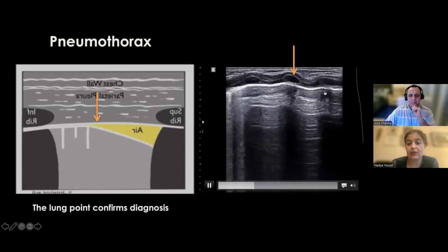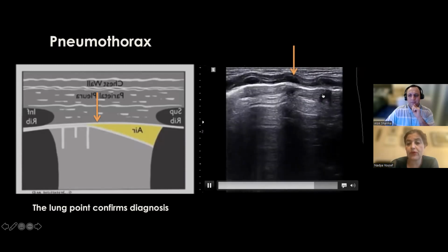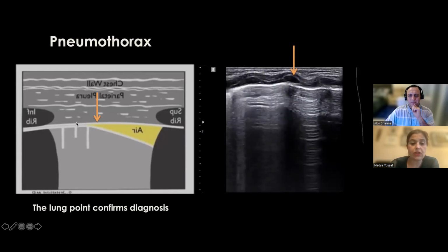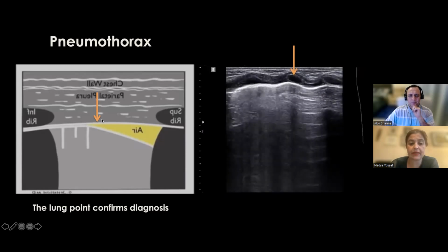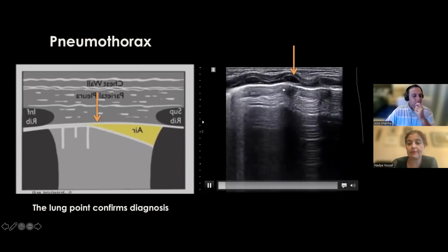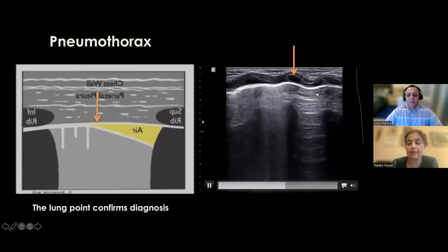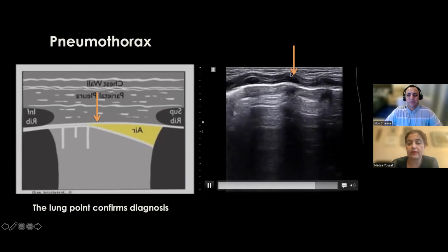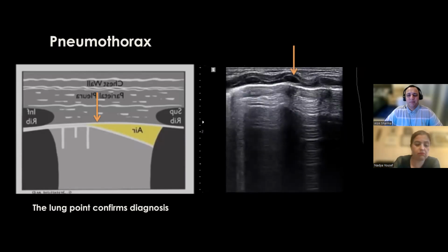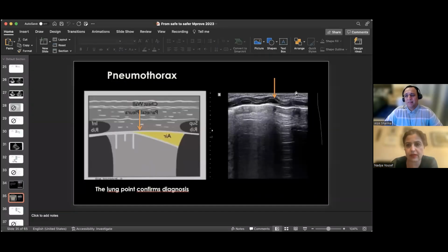And if you then see that you have no lung sliding, you only have A lines, no B lines, and if you're using the M mode, you have the stratosphere sign, then you will start to move your probe laterally, until you start seeing a different pattern. This is the lung point. On this clip, where you have the orange arrow, this is where you have sliding and, at the same time, no sliding. This is the lung point. Basically, the lung point is the point of separation of the two pleura, what you see on lung ultrasound in that case. Did I answer your question, Mara?